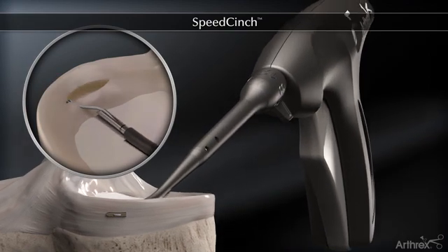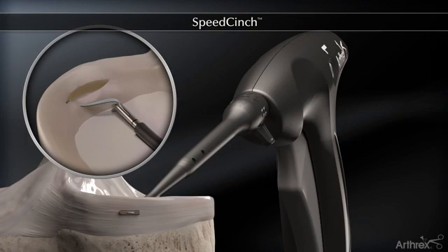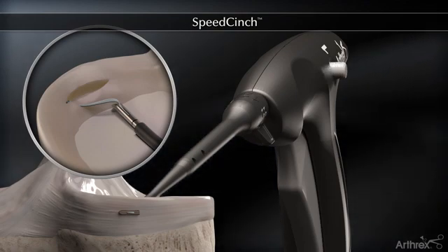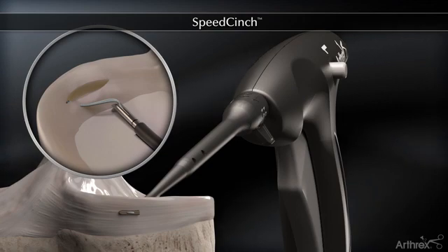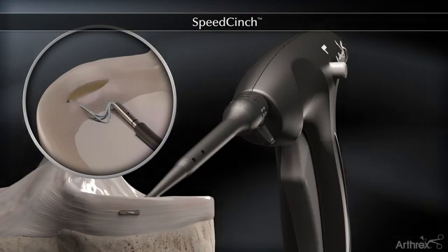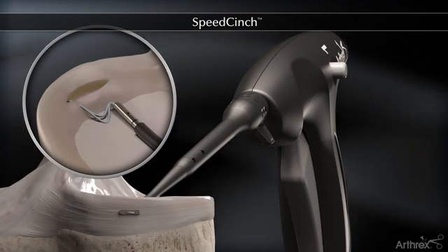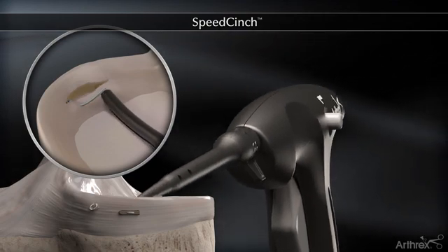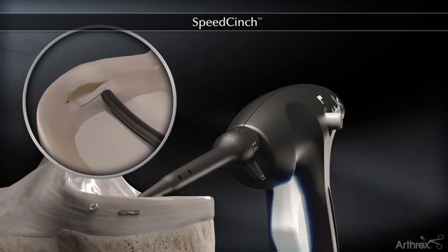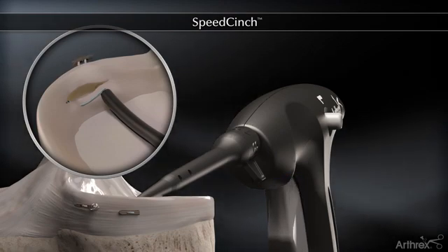Remove the needle and move to the second desired implant location. Depress button number two to engage implant number two. Actuate the trigger to the first click to advance the implant to the tip of the needle. Hold the trigger in this position. Advance the needle through the meniscus to the desired depth and actuate the trigger further to the second click to deploy implant number two.